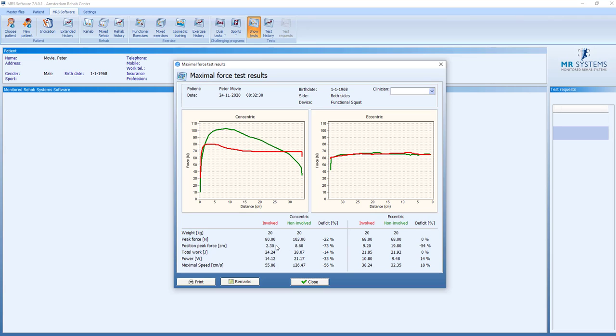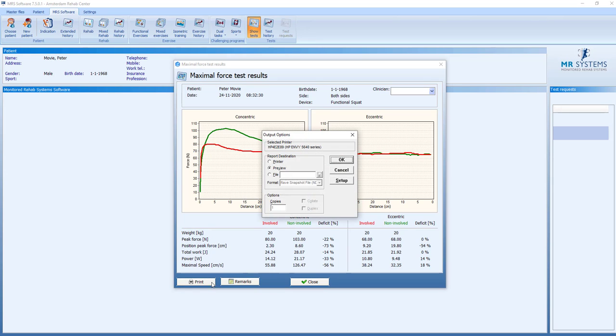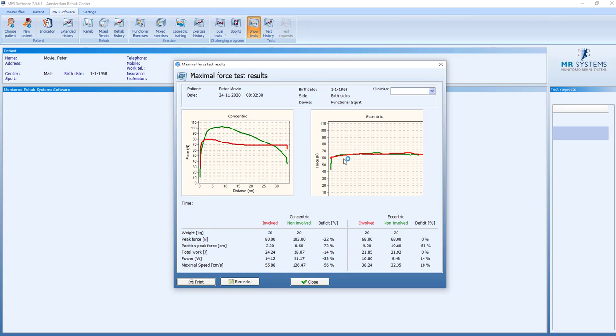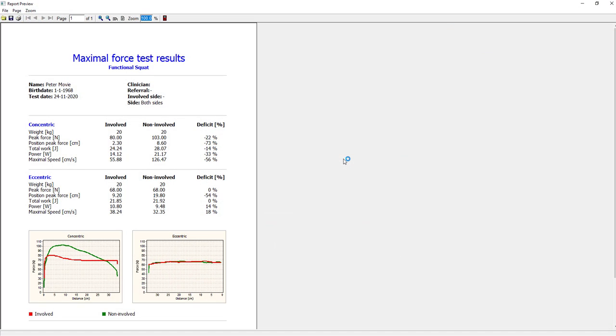But what we see, there's a difference in force, the position of peak, the total work and the power. And it's all because there's a difference in speed. So the involved side was able to do the 20 kilos, but not at the same speed. We can print and get all the results.